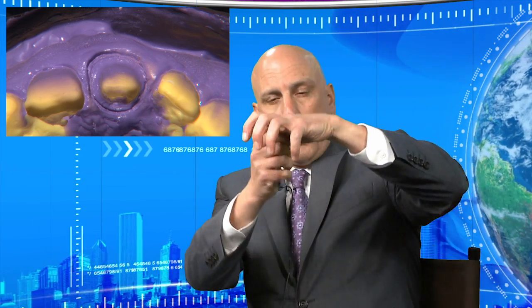The medium body material goes into that wide-open sulcus, making contact with the double-zero cord. When you pull the impression out, you're pulling one way but the cord wants to stay, stretching the material. With light body it was tearing; with medium body it peels right off the cord — sometimes it pulls the cord out with it, which is fine since the impression is already done. Best case, the cord stays in and we remove it at the end of the appointment to avoid leaving temporary cement in the sulcus.